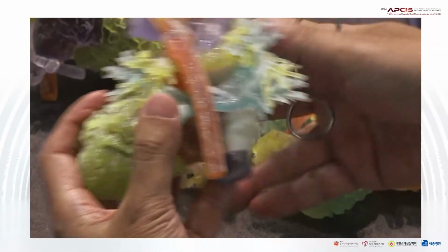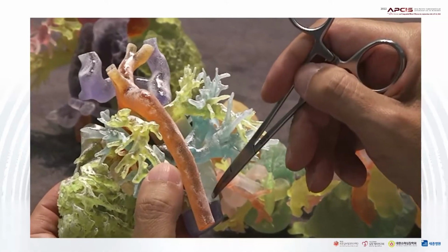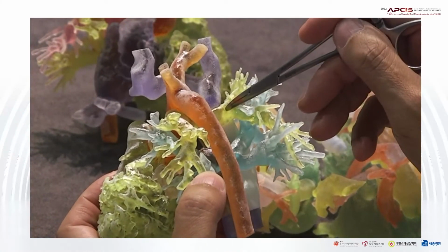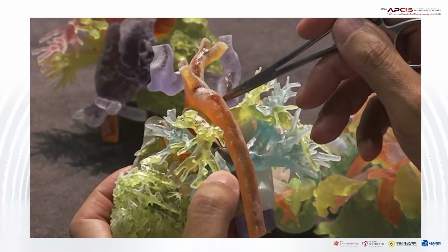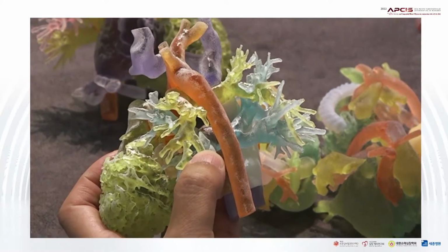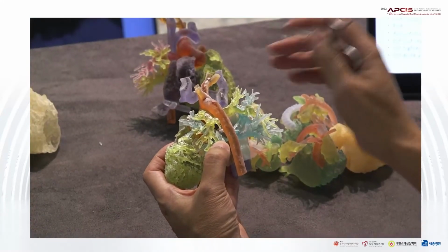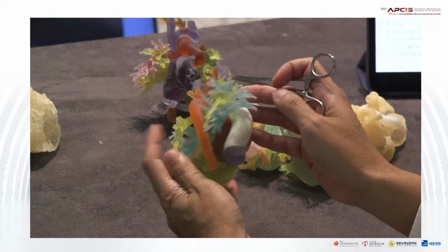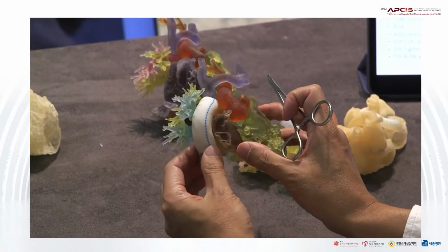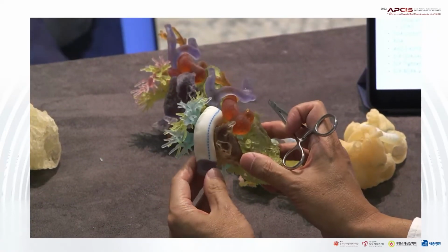Looking from the back, you can see the SVC and IVC are both connected to the pulmonary arterial system. So in this way, the whole systemic venous blood now flows directly through the pulmonary arterial circulation without entering the single ventricle. So this is the completion of a long journey from neonate to the Fontan operation.